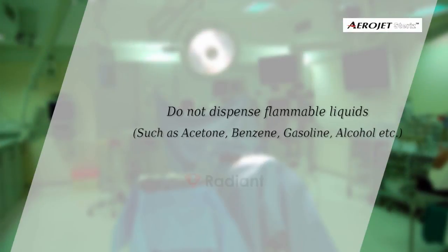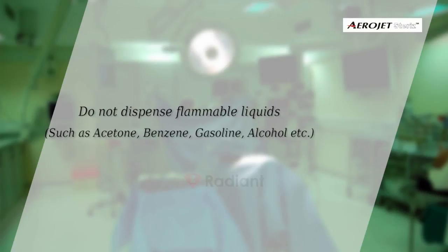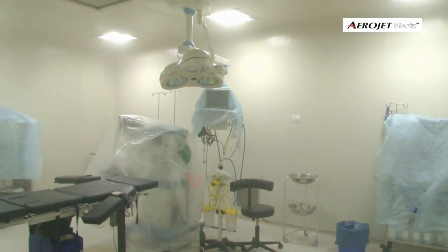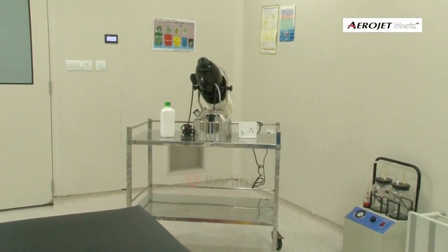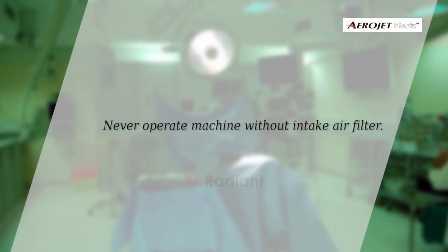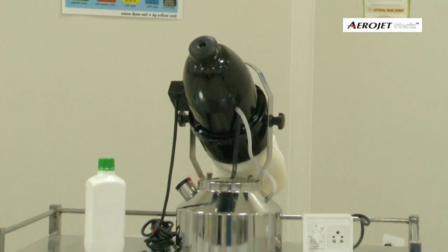Do not dispense flammable liquids such as acetone, benzene, gasoline, or alcohol. Never fog near or toward an open flame. Cover electronic equipment with linen or plastic cover. High-speed motors of the machine should not be kept running continuously for more than necessary. Never operate the machine without the intake air filter.